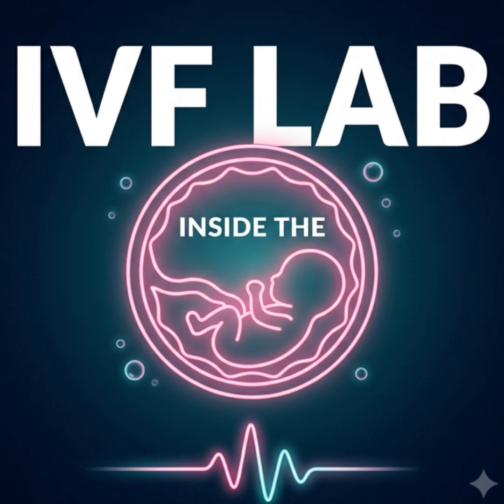Time-lapse also cannot guarantee implantation, because implantation is a two-way dialogue. It relies on the biological receptivity and immune environment of the uterus just as much as the quality of the embryo, and it certainly cannot guarantee a live birth. The key takeaway here is fundamental to understanding IVF. Seeing more of development is not the same as fully understanding development.